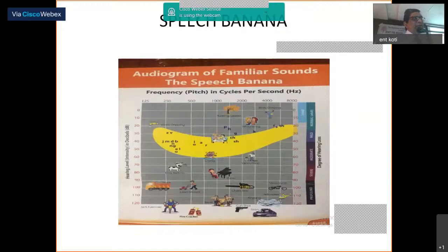Once you activate the 512 tuning fork, it continues to deliver sound so that in the meantime you can complete the Rinne test, air conduction, bone conduction, and also your absolute bone conduction. If you take a higher frequency tuning fork, the amount of sound delivered is less, so it will not be enough for you to do the test.